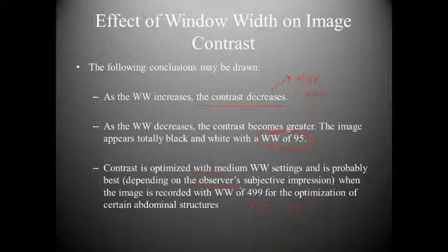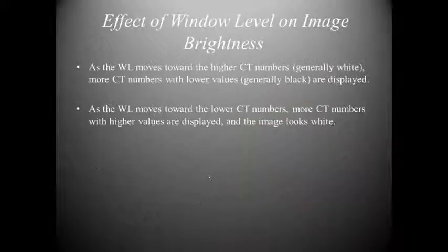But notice that this is usually dependent on the observer's subjective impression. So not everyone is going to look at the image and say that this is correct or the most correct way. Usually it depends on how you've been trained and what kind of suits your palate. Some physicians and some techs like to look at structures darker, and some like to look at them lighter. And so it all becomes subjective because we do have this range and this freedom of being able to adjust things as we see fit.